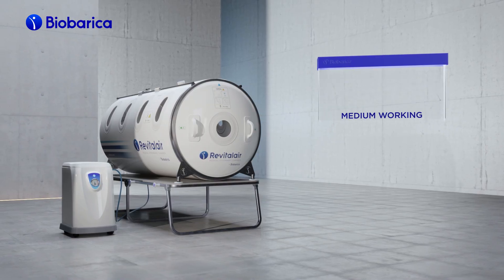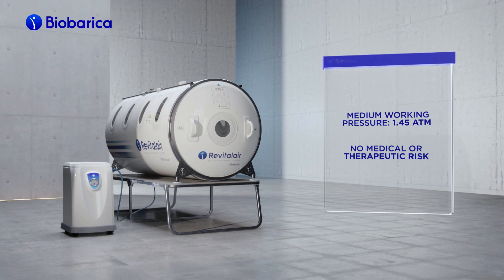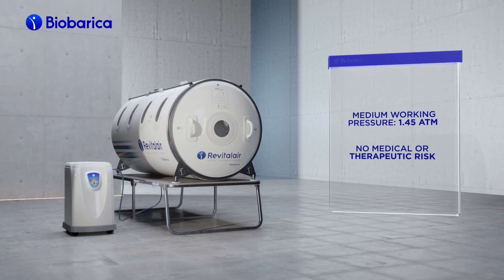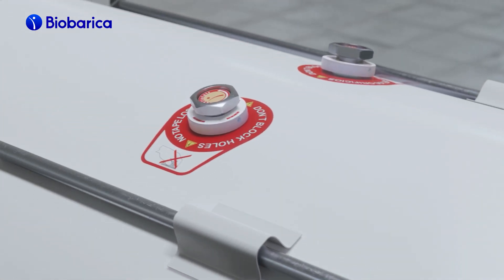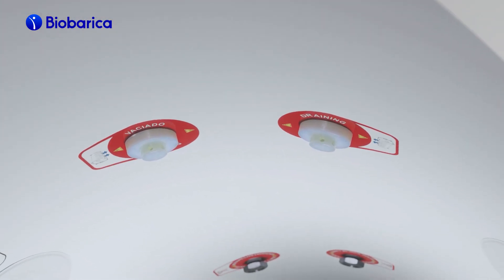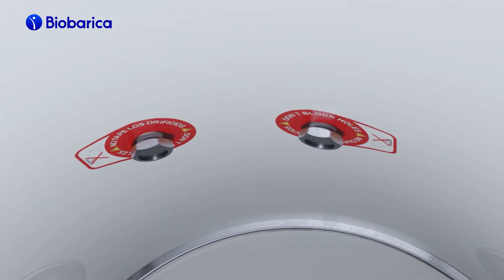The Hyperbaric Chamber Revital Air 430 works with a safe medium pressure of 1.45 atmospheres, which does not carry the technical and therapeutic risk of high pressure chambers. The chamber has two relief valves and two dual-operated dump valves to regulate the pressure. This feature allows the professional to regulate them from the outside, or the patient to operate them internally if necessary.